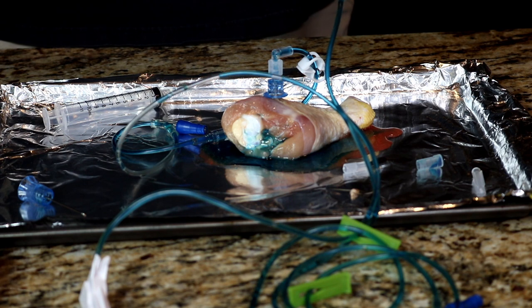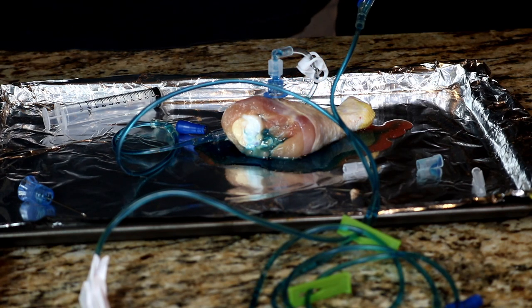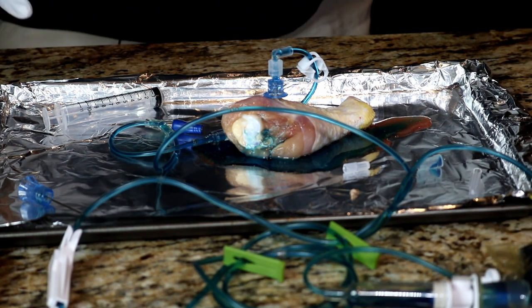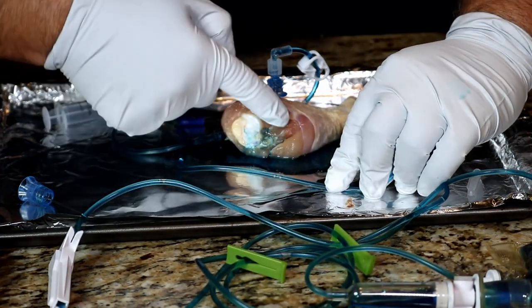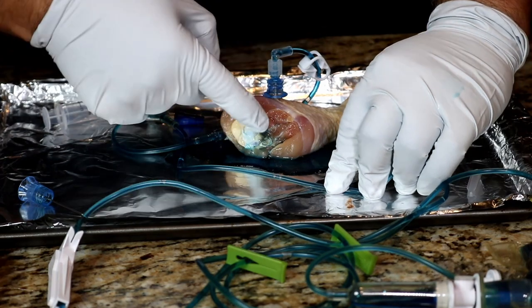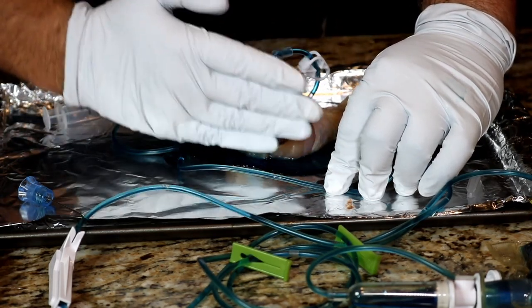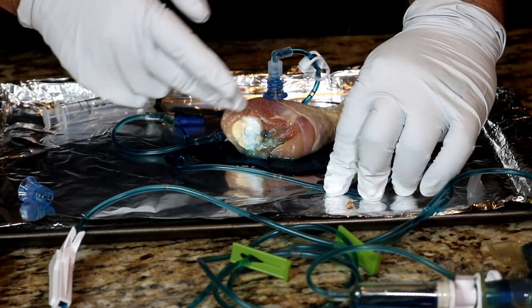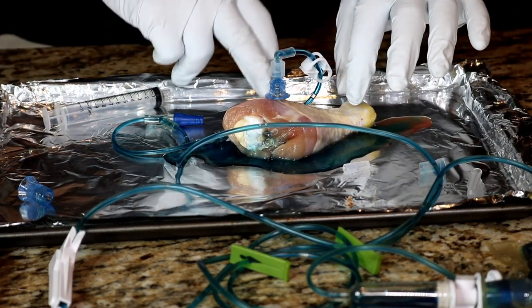You get the idea here. You can see the fluid coming out pretty quick even with an air bubble in there. This is a viable — more than viable — way to do this. You can see how it's turned the tissue blue. The reason it's coming out right there and not turning the whole chicken leg blue is because the bone has been cut from where it's been butchered and placed in the package, so it's leaking out where it's cut and where the marrow is.